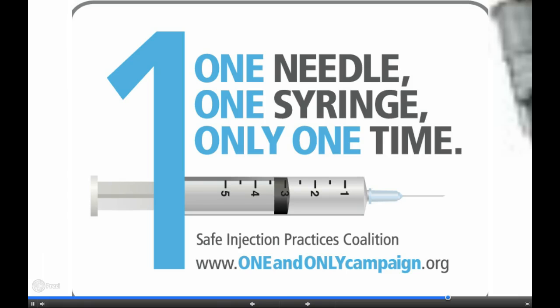To avoid contamination of the inside of the syringe and its contents, be careful not to touch the plunger of the syringe while drawing up or delivering meds. If medication is in pre-packaged syringes, the syringes must stay in the package until you are ready to administer them. The pocket of your scrubs is also not a storage place for syringes, whether the needle is attached or not.